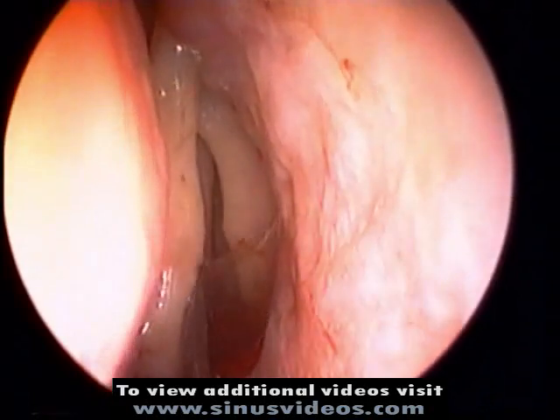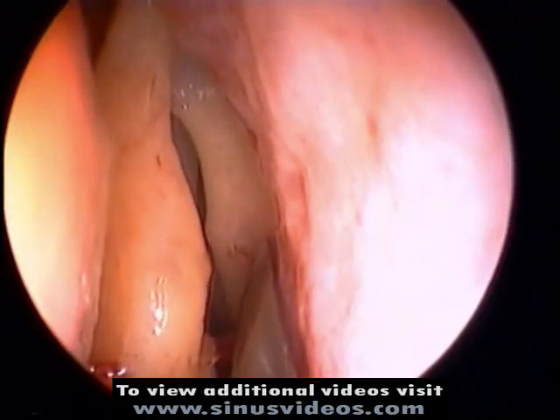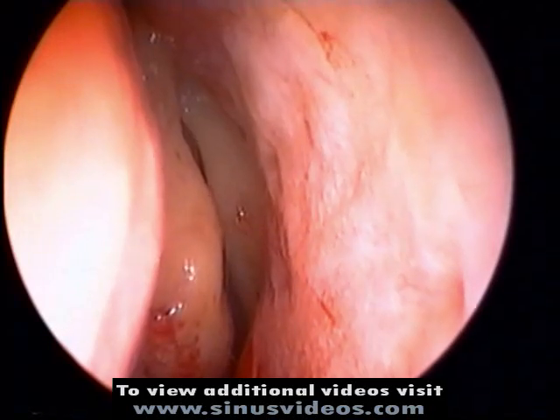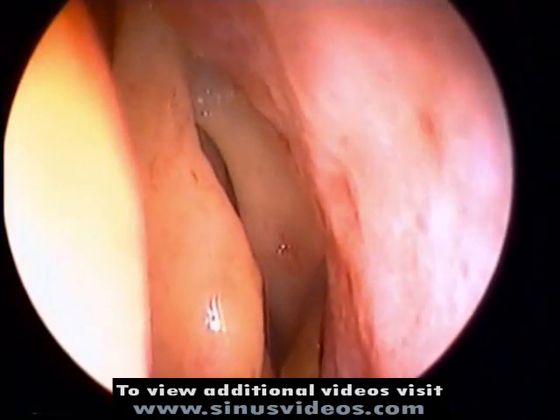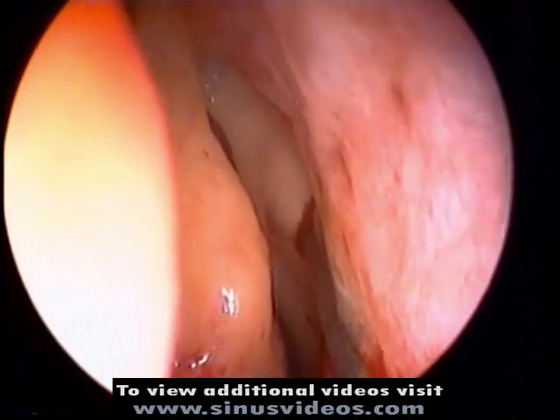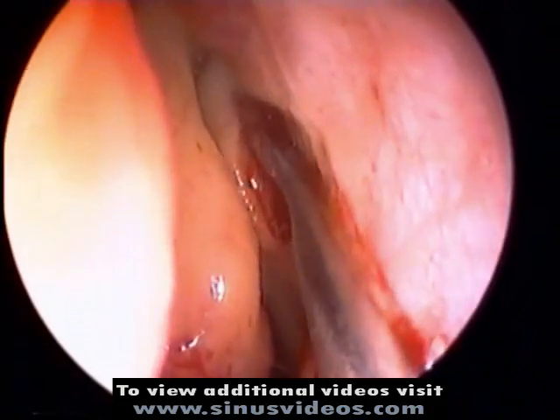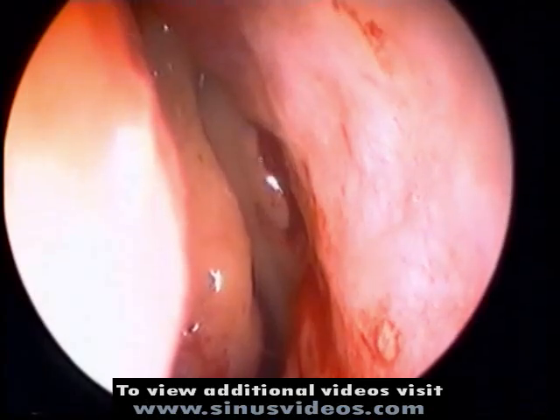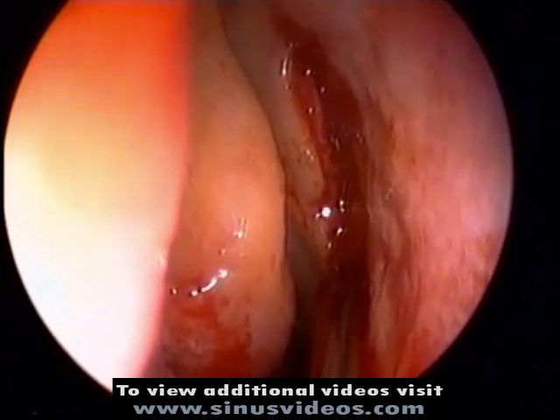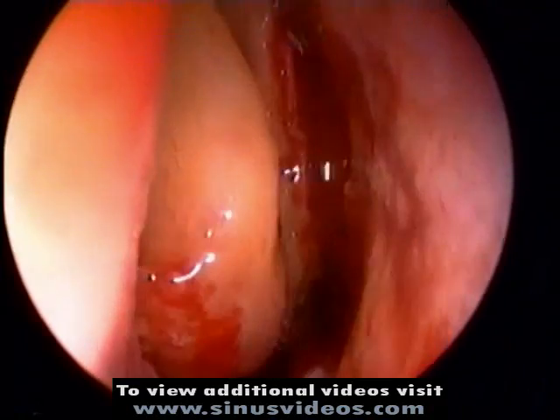Once nasal packing containing a 4% cocaine solution has been removed, the middle turbinate is infractured to expose the uncinate process. This process is removed with a sickle knife, which incises mucosa, bone, as well as an additional layer of mucosa on the lateral aspect of the uncinate process. Once the incision has been taken superiorly to the region of the frontal recess, it is then continued in an inferior direction towards the maxillary sinus ostium.